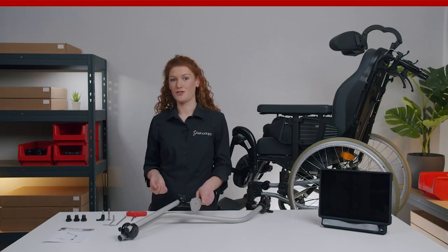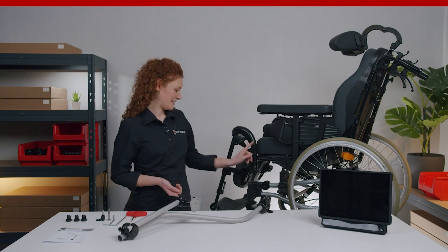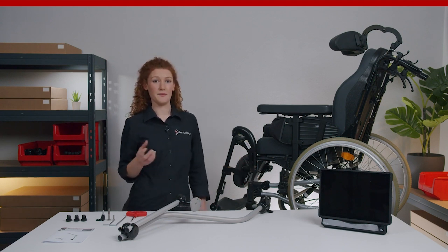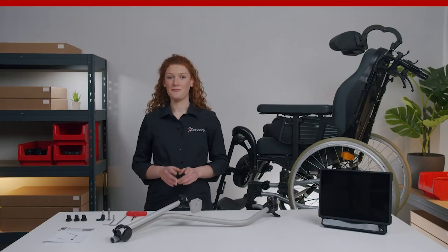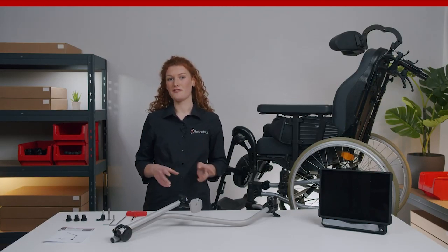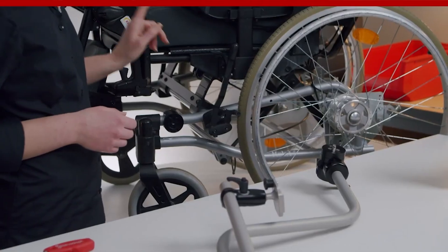Now I will show you how to assemble the M3D curved L bundle correctly on this wheelchair. First we start with the frame clamp. This is the most important part because it creates a base for the mount that is semi-permanently attached to the wheelchair. There is a frame clamp for every wheelchair but it's not included in the bundle, so you have to order it separately. For this wheelchair we need the RQL25.